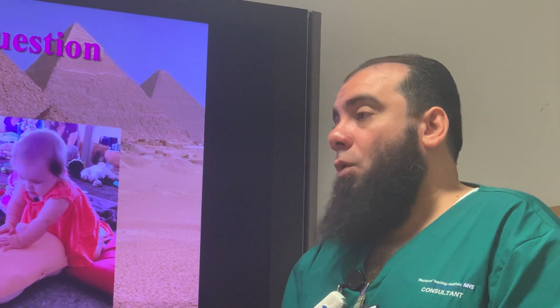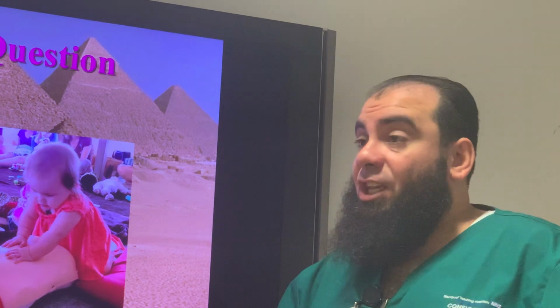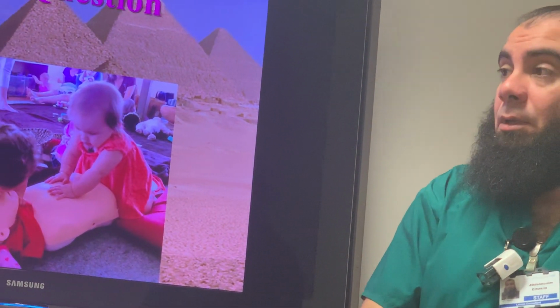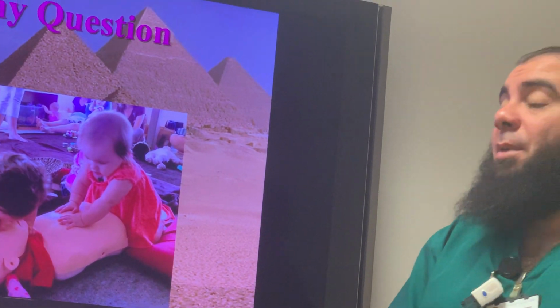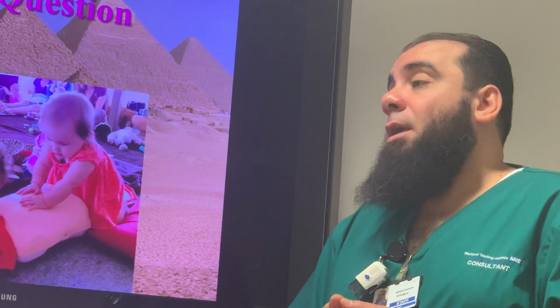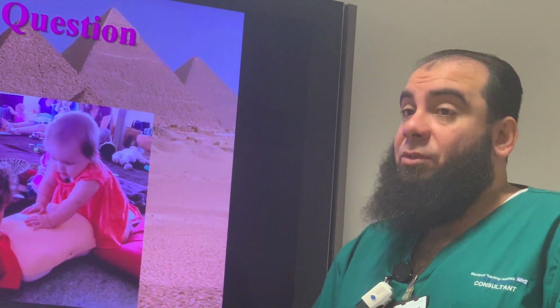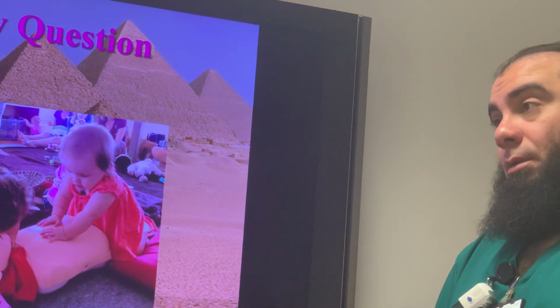He cannot go home. The other type is type B, with deep inverted equal limbs, with no difference between the descending and ascending limb. Same pattern, like the letter V in V1 and V2, and very significant for Wellens syndrome type B, with the same significance of left anterior descending as well.